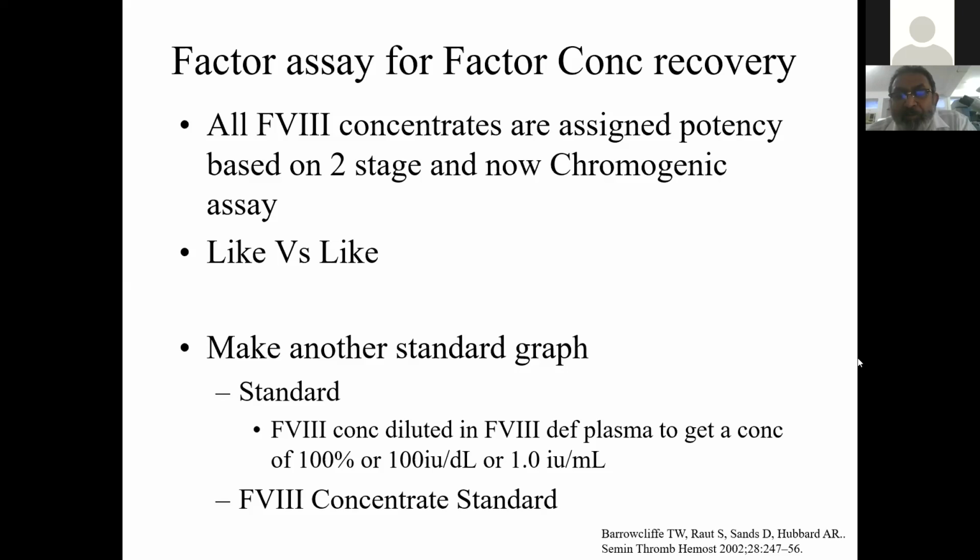That's why I always wondered, in the factor VIII and factor IX subcommittee, there is a discussion on one-stage factor assay and chromogenic assay, but nobody talks about the like versus like principle. So I think this like versus like principle is very useful till you start using chromogenic assay. Now chromogenic assay, we were using it only to find out any issues related to our results of the recovery assay, which is done by like versus like one-stage assay versus what was calculated.